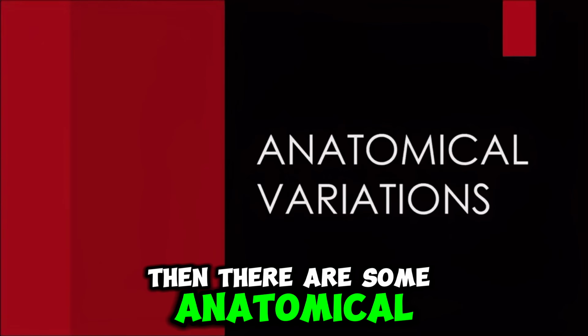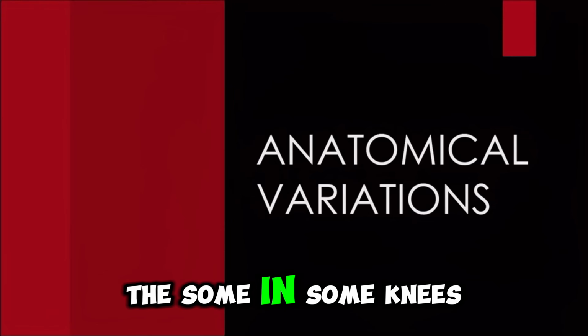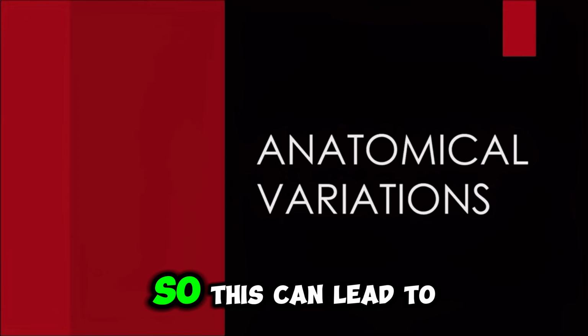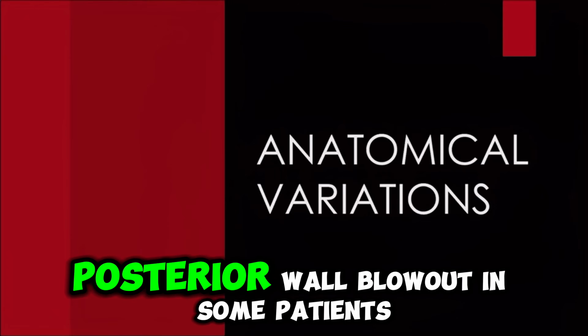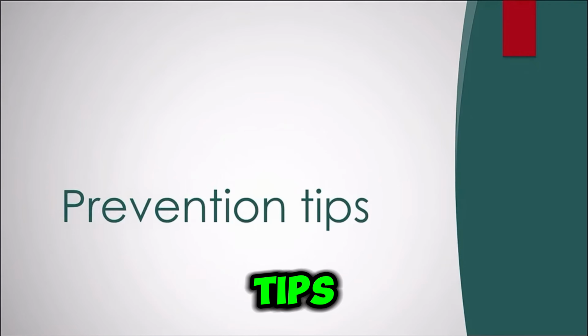Then there are some anatomical variations: the degree of sloping of the knee, and in some knees the intercondylar ridge is visible, sometimes not. This can lead to posterior wall blowout in some patients. Then what are the prevention tips?